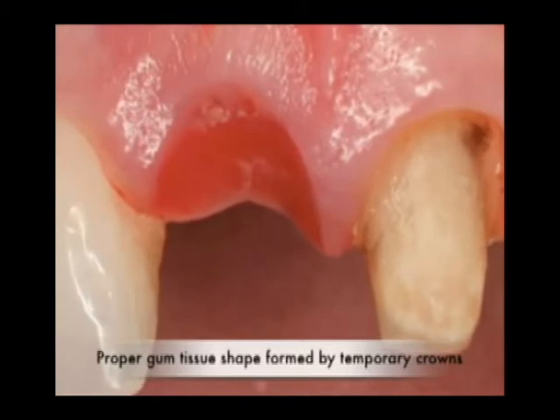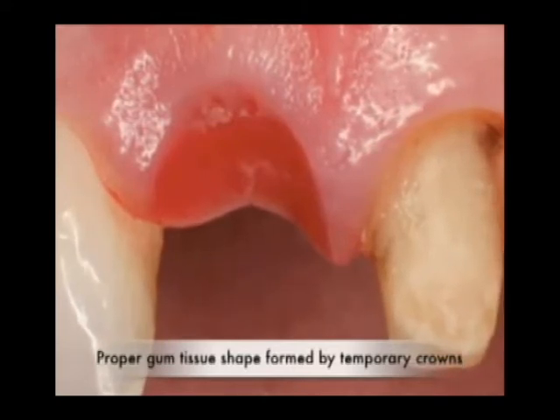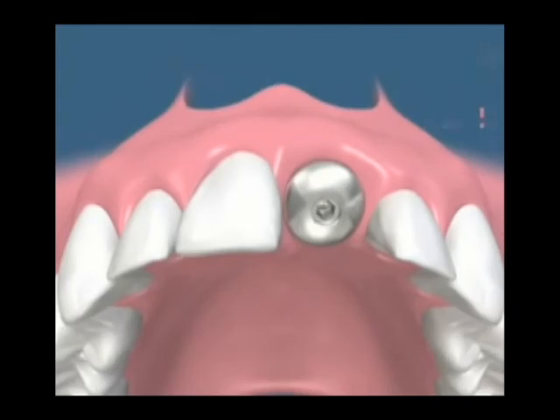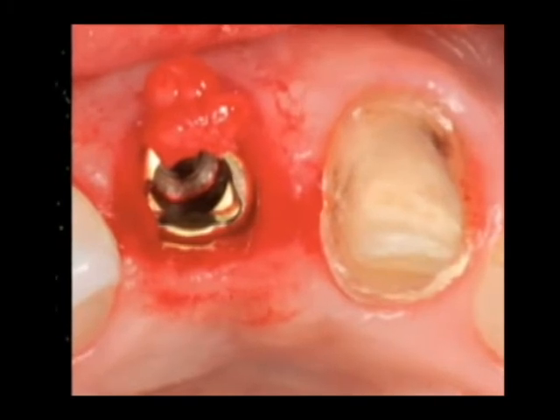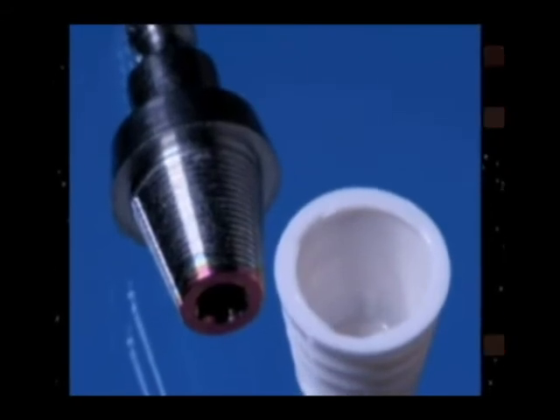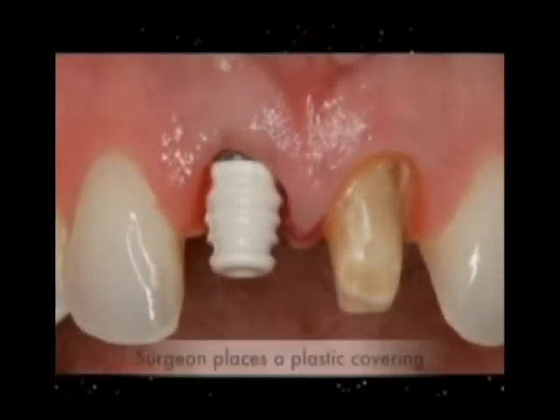And we very conservatively analyze this area for the placement of the implant, and we measure the site, and we choose the right implant and place it into the area where the tooth was removed several months earlier, with, again, the same considerations of depth and width and position for optimal tissue health, and us to be able to place an immediate temporary abutment.